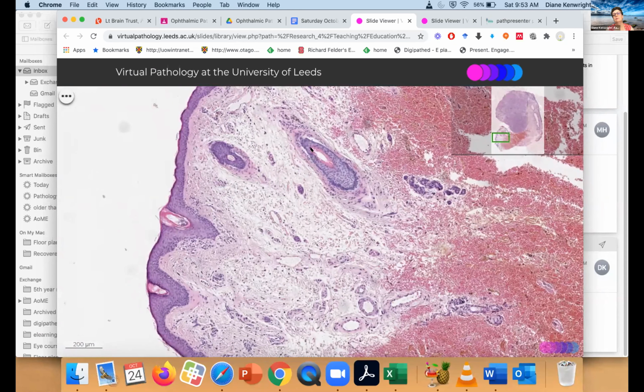And looking more closely at the cells, I confirm that these cells have got big nucleoli and they've kind of got an epithelioid look. And I know that melanomas can be spindle or epithelioid. I also know that the cell type doesn't matter in the prognosis of skin lesions. So we've got this large dermal-based tumor that has a junctional component and an invasive malignant component. And as I look around, I can see the pleomorphism of the cells. Mitoses are relatively infrequent, but this is normal for melanoma.